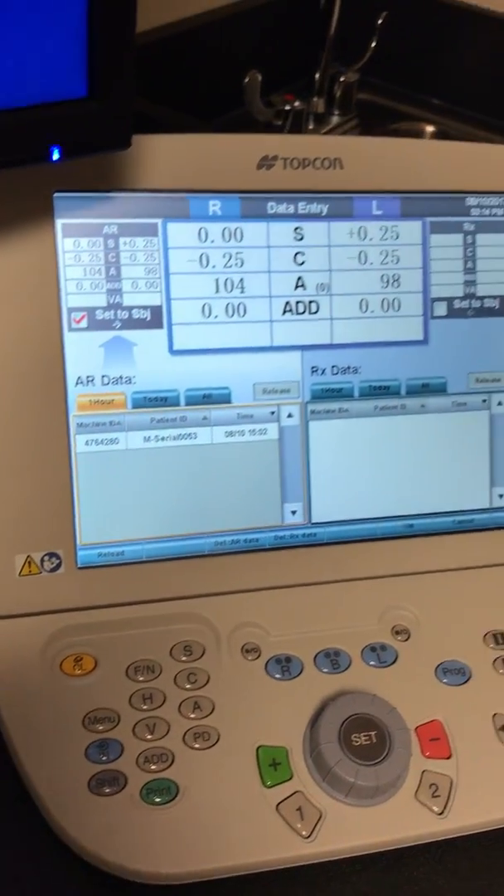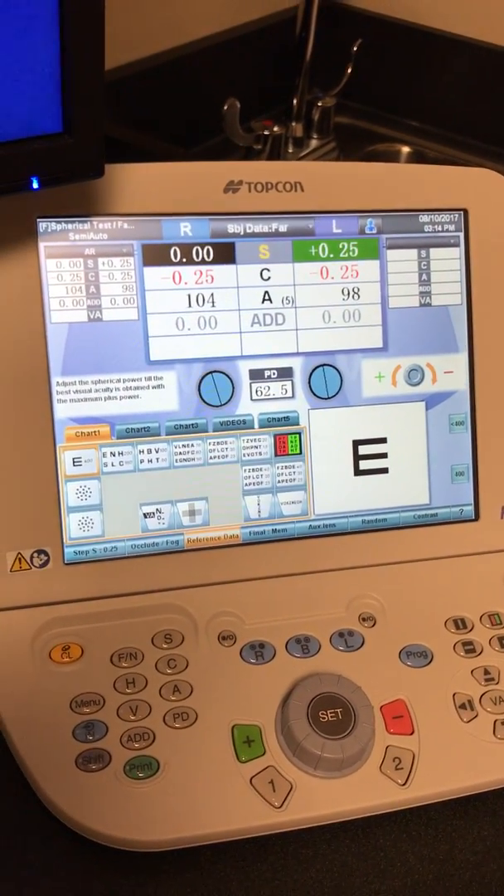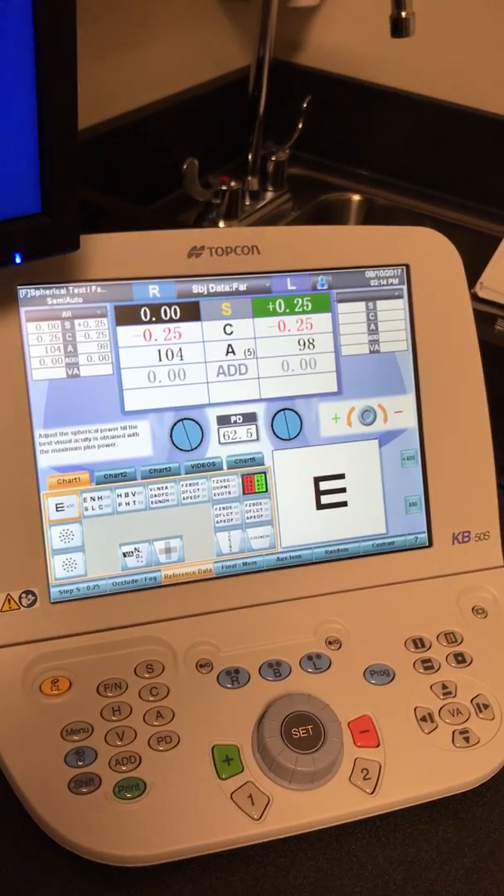So you have number 53 that matches up. You hit that button there. It'll put the data right here, and all you have to do is hit OK. It'll dial the information into the phoropter already.